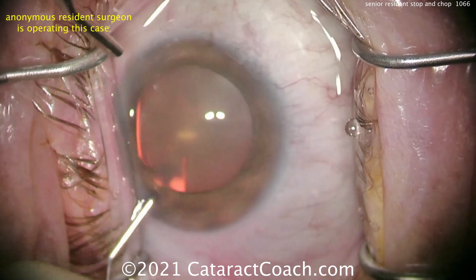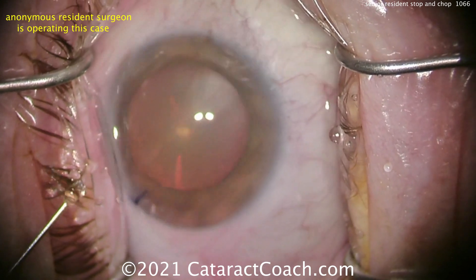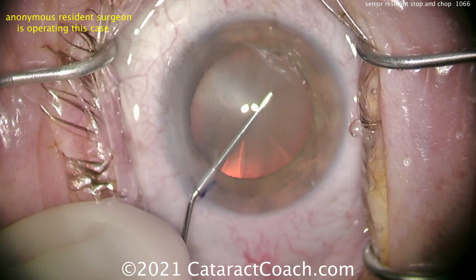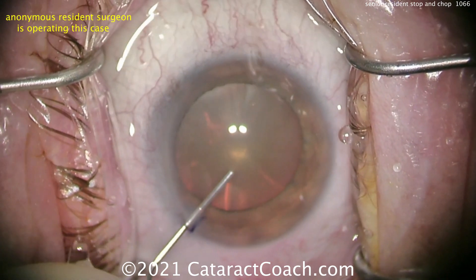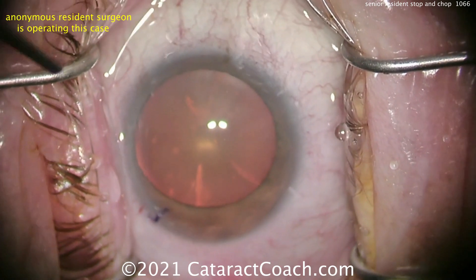Right about now that's some anesthetic going inside the anterior chamber to help. Looks like the patient's probably at the top of the anesthesia because there's a lot of eye movement. There's our viscoelastic fill — a nice dispersive viscoelastic, good fill. I like that.